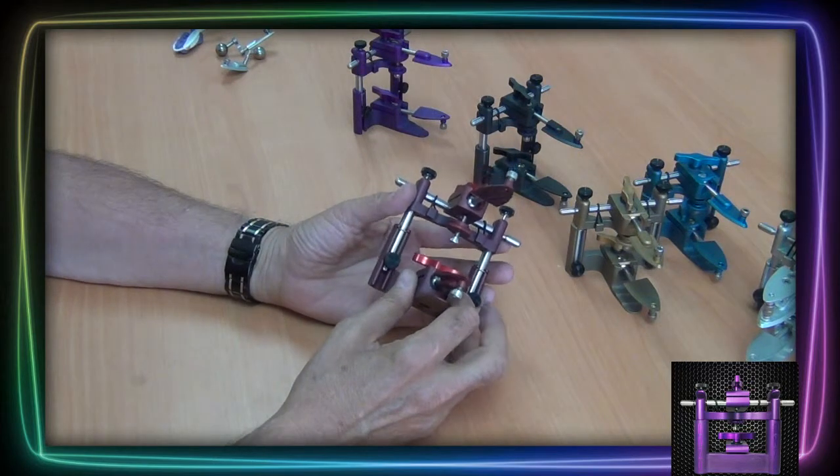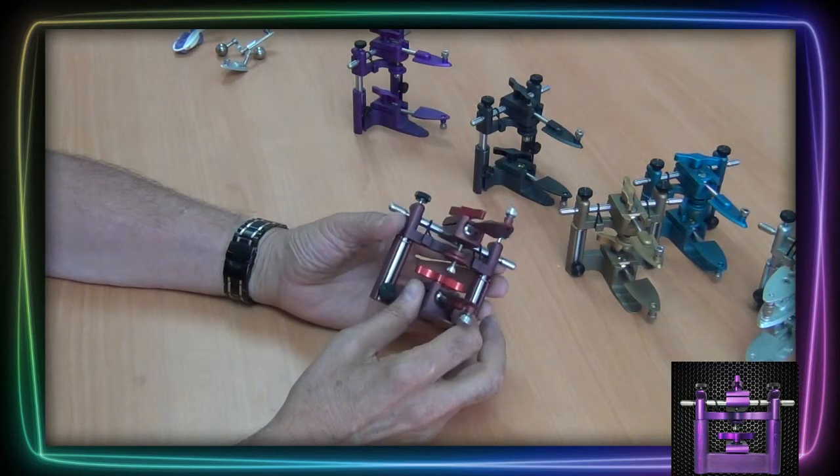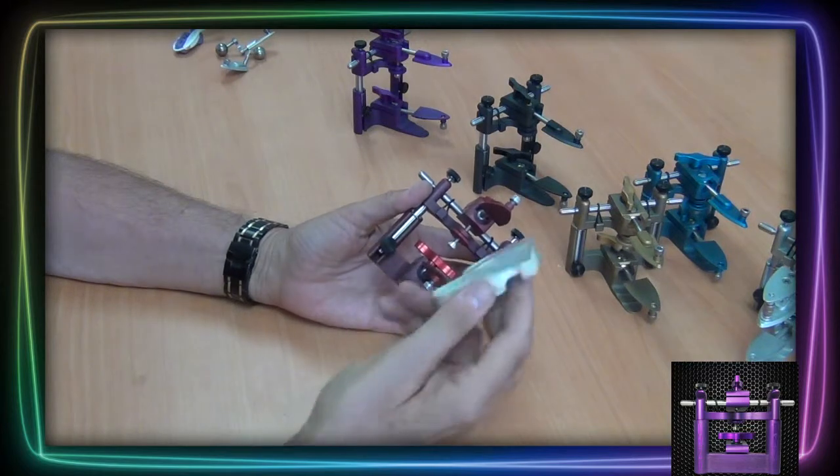As shown in another video demonstration, the Articulator works smoothly with the iTero Mono System.